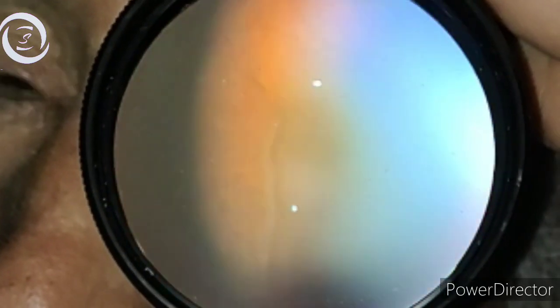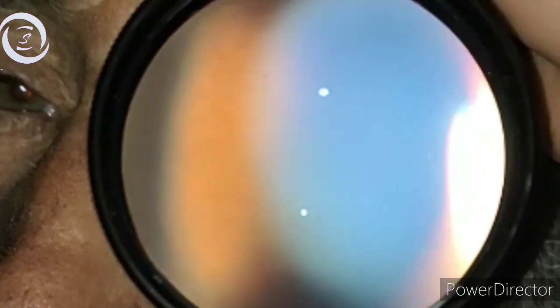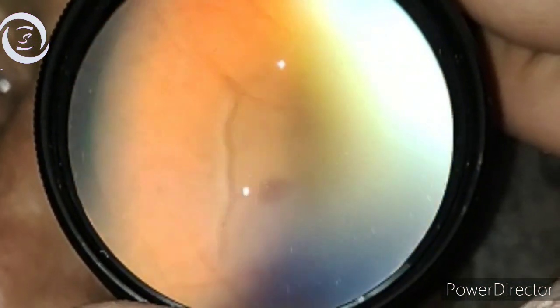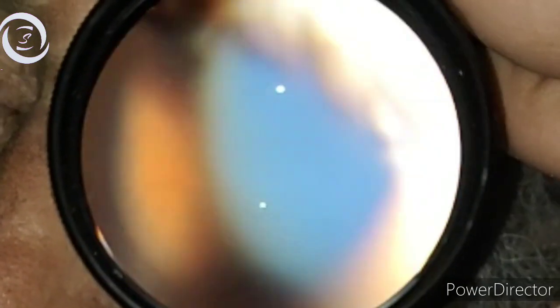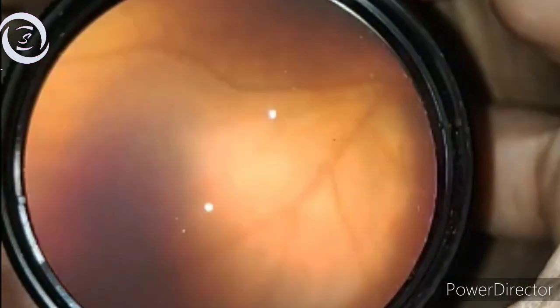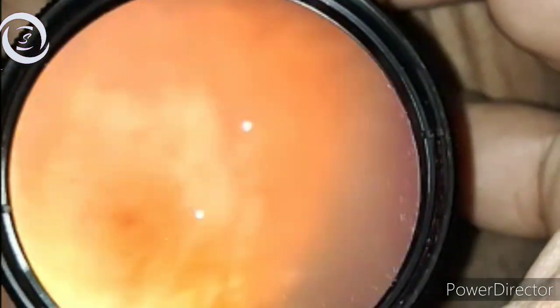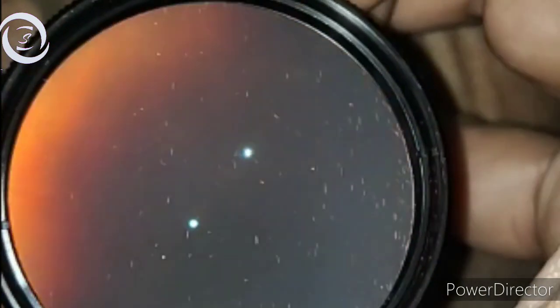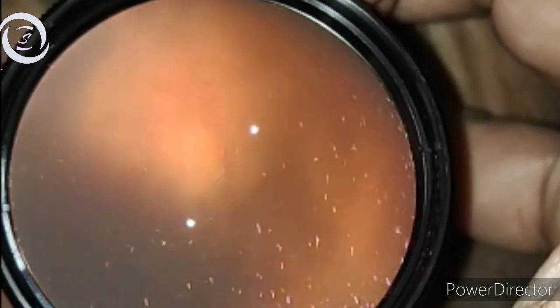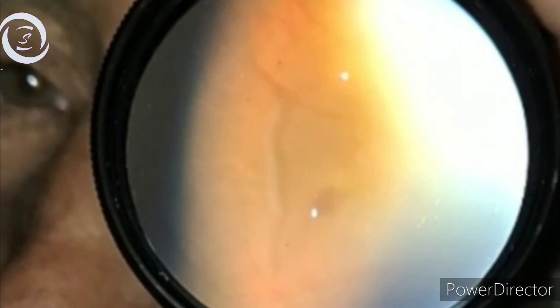Here you can clearly see on 20 diopter lens on the indirect fundus examination there is a thread-like linear opacity just above the macula, temporal to the fovea, casting shadow on the retina. So worms also cast shadow on the retina — that's one of their features and you have to rule out worms.